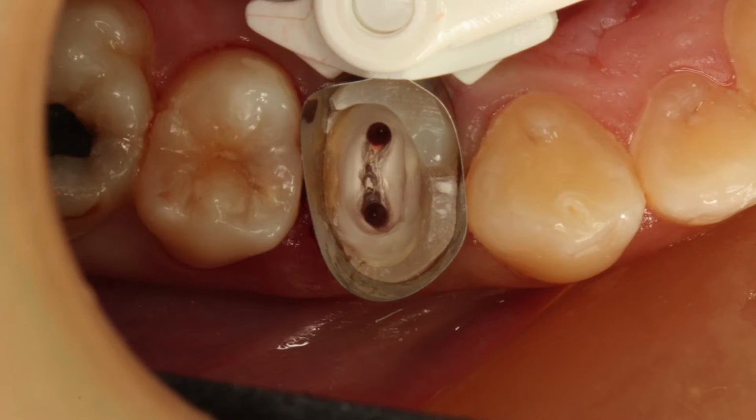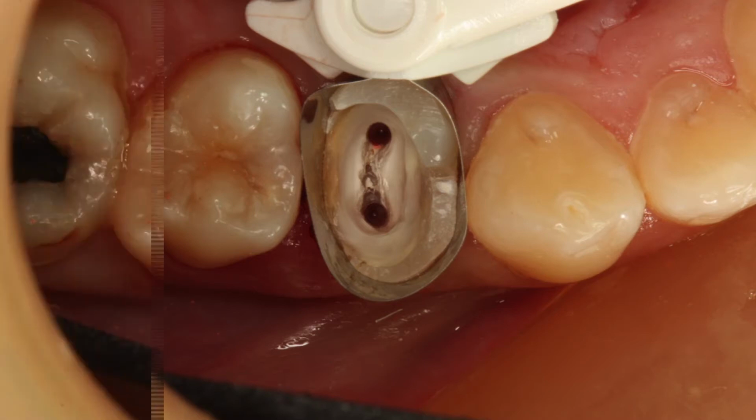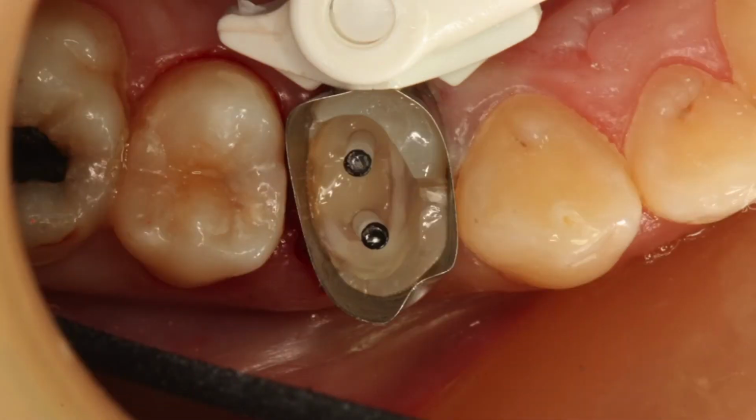Yeah. And what are you going to drop a couple titanium or metal posts in here at this point? These are going to be resin reinforced. The black dots on top, it looks like they're metal, Mike. I was joking, Gary. I knew you would never put a metal post in. There would have to be a gun to your head, or somebody at your house with a gun to your family's head saying, "Put this metal post in." I was trying to be polite. I know, thank you.